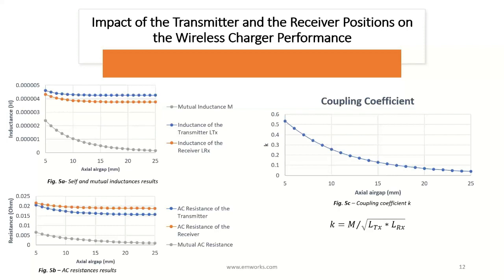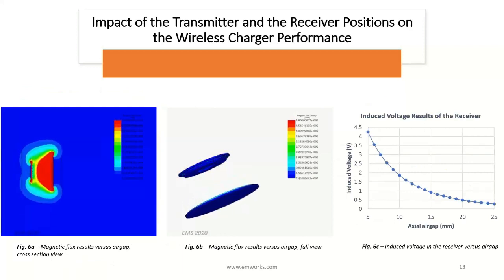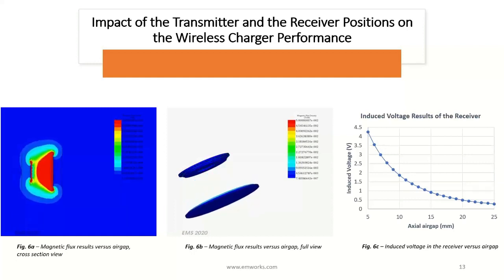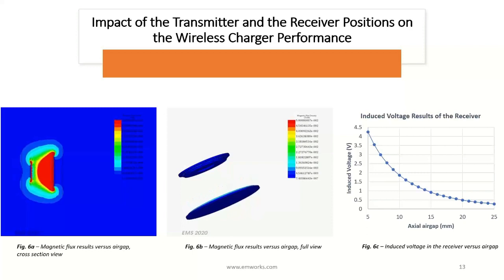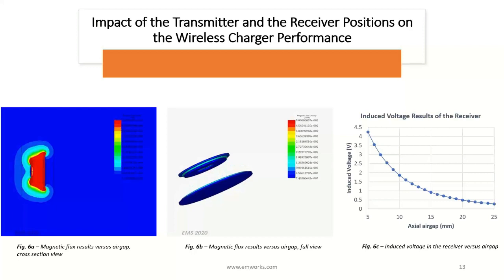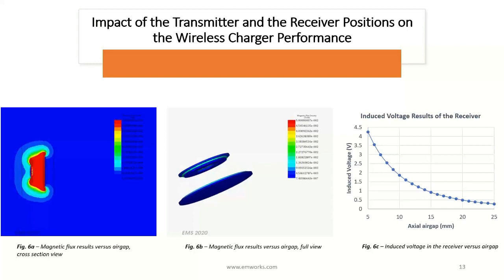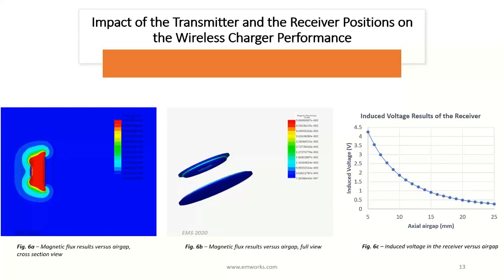The results of the coupling coefficient K calculated by EMS are plotted in figure 5c. It also decreases when the air gap increases. To make things clearer, the magnetic flux density plot versus different air gaps is shown in figure 6a. It can be seen that less magnetic field can reach the receiver coil when the air gap distance increases. This explains why the induced back EMF in the receiver coil becomes smaller with the air gap, as shown in figure 6c. It shows that when the air gap is only 5 mm, the receiver voltage reaches a peak value around 4 volts, while it is less than 0.5 volt when the air gap exceeds 20 mm.